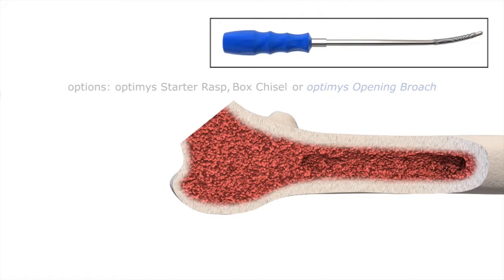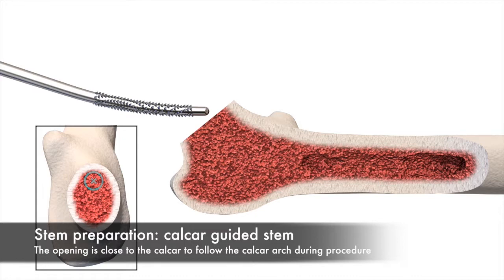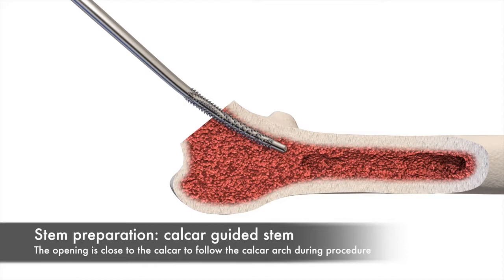Stem preparation. Calcar guided stem. The opening is close to the calcar to follow the calcar arch during the procedure.